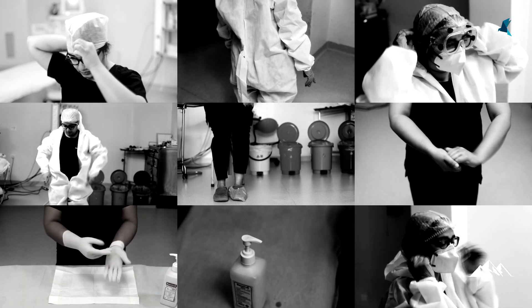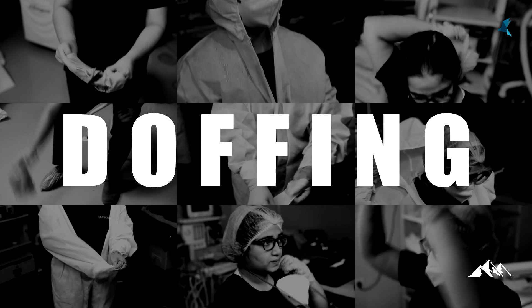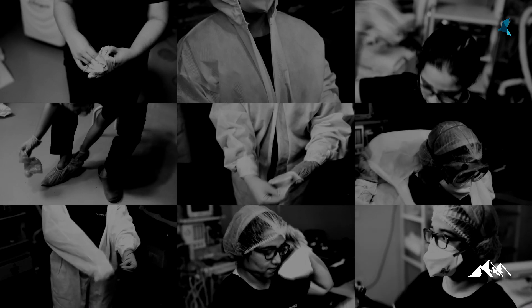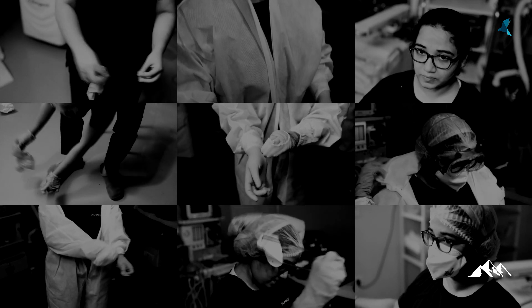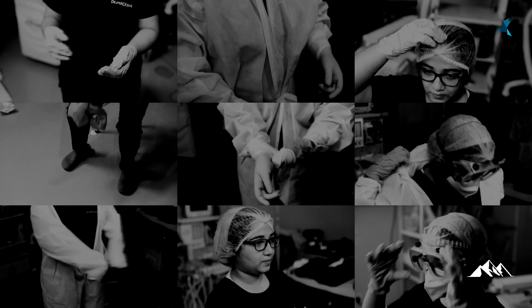That completes the donning process. Now we can proceed towards the steps of doffing. Doffing is the process by which we remove the PPE. It is not the exact reverse of donning, because doffing is done by first removing the most possibly contaminated equipment. Here is a brief and quick view into the steps of doffing.